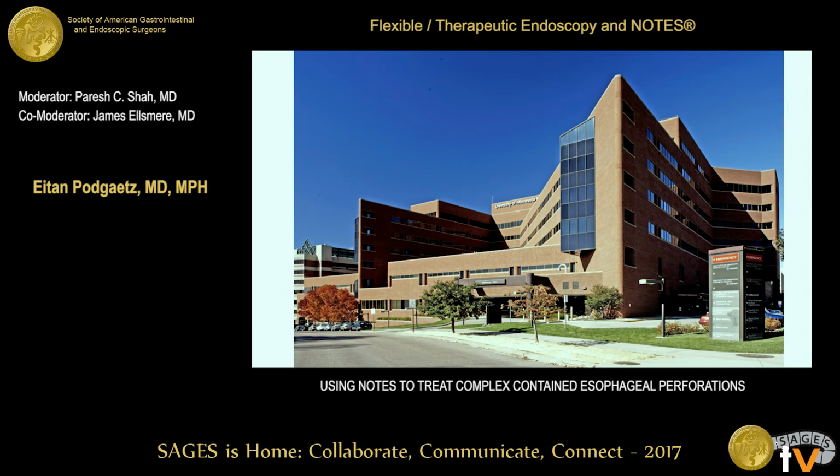With more experience, maybe we'll get bolder with those, but the cases that you had seemed like they were pretty ugly. And also, they seemed like the holes were bigger. A lot of tissue loss. Like you could actually get a big tube in there and a little double J might fall out. We'll see. It's definitely better for the abdomen. It's an interesting concept, and I agree. It's completely in evolution, and it's going to be an exciting time to see how it evolves.